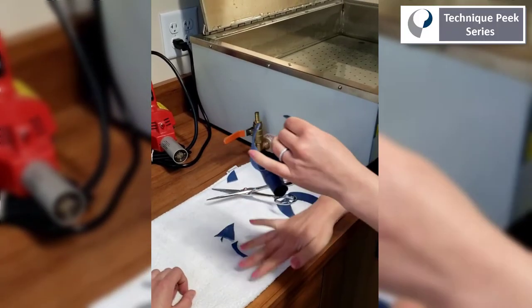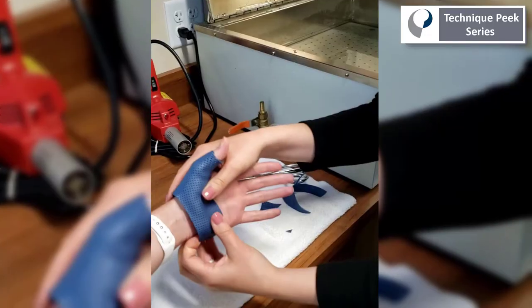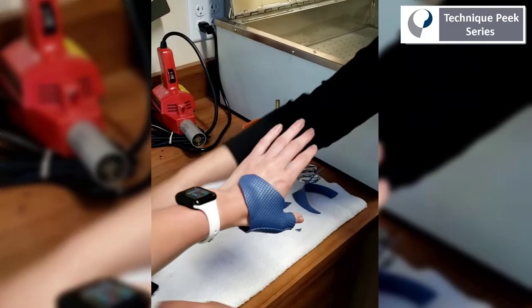Once we've finished rounding the edges, we'll check for the fit. Make sure the wrist is clear, the IP joint of the thumb is free to move, and then we'll add a Velcro strap.